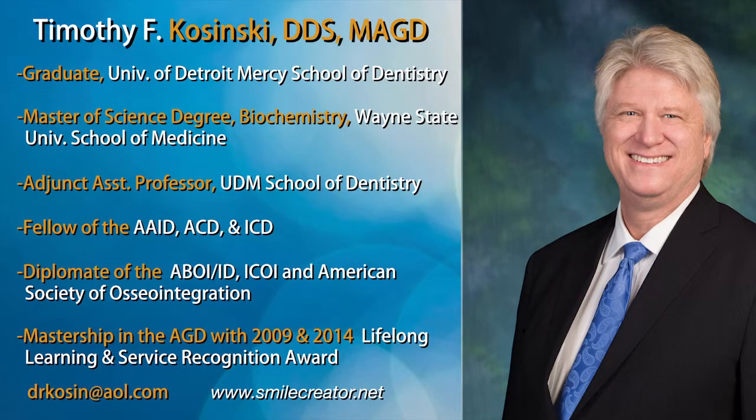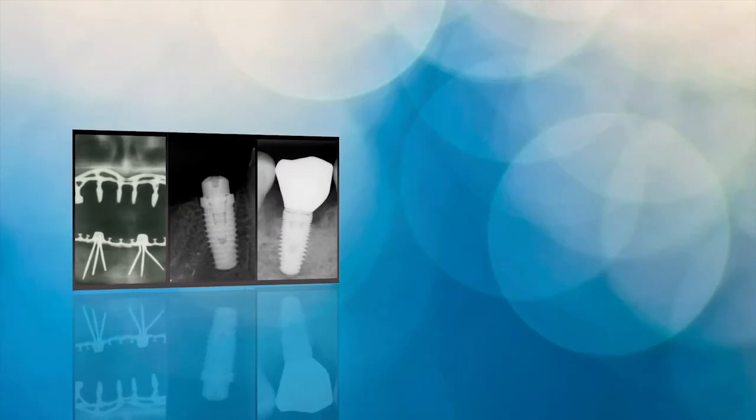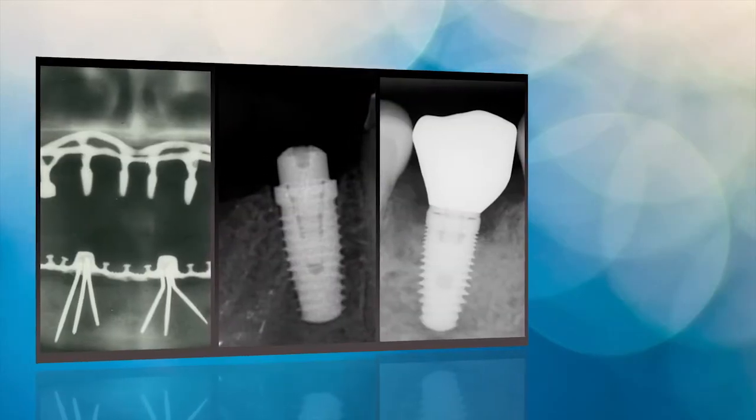I'm Dr. Tim Kosinski, and today's topic is optimizing anterior aesthetics with the inclusive tooth replacement system. Implant treatment has changed so much over the years.